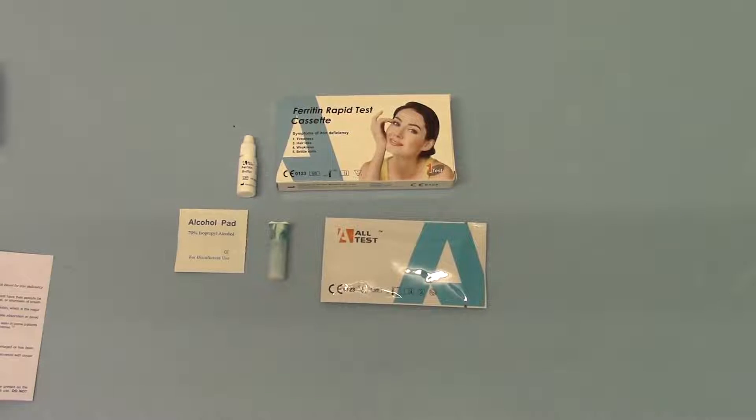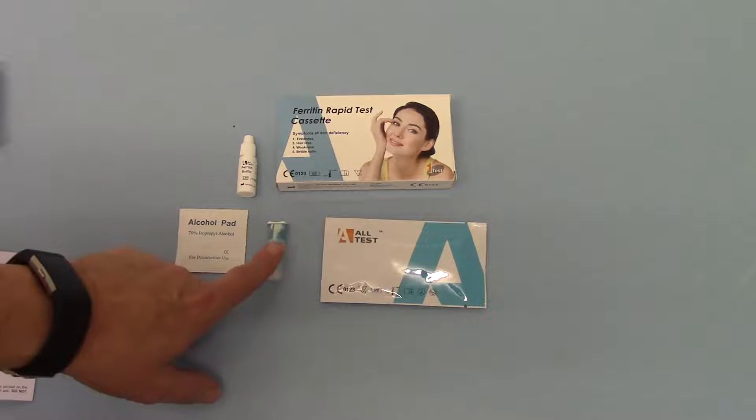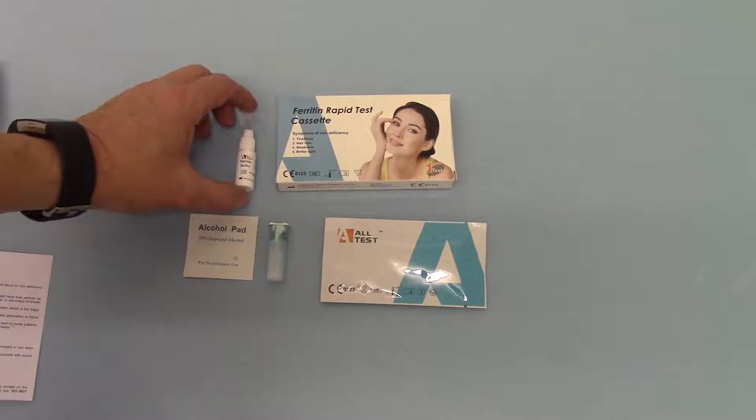Welcome to this product demonstration for the new AllTest Ferritin Home Test or Self-Test pack. This is a complete home test including a lancet to do your finger prick to determine whether you have a low level of ferritin or an iron deficiency anemia. The pack contains a test cassette with a micro pipette, a lancet, an alcohol wipe to wipe your finger, and a buffer solution.